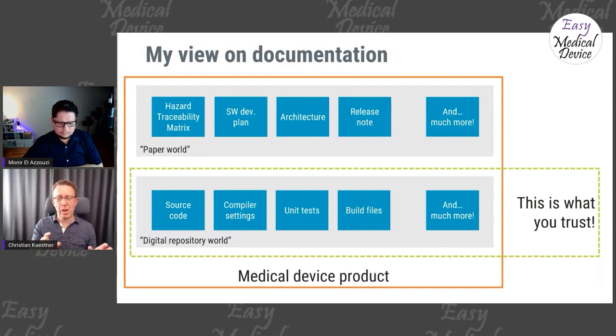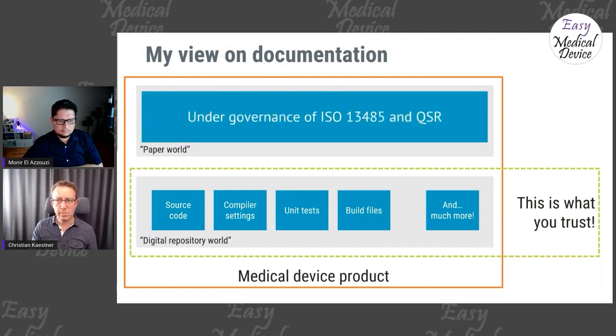So whatever you do in the digital, when working with software, whatever you do in the digital repository world, that's the actual output that you will face the patient with. That has nothing to do with the amount of signatures and document numbers and things. So there's a huge trust in what's happening in the digital world.